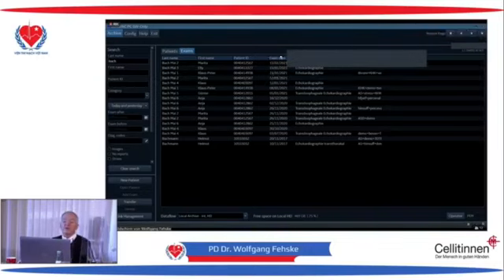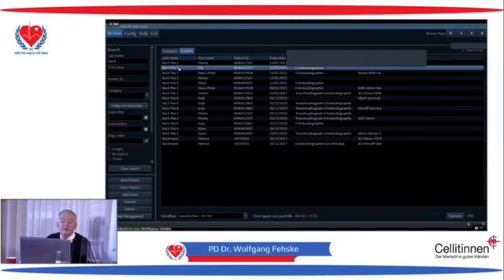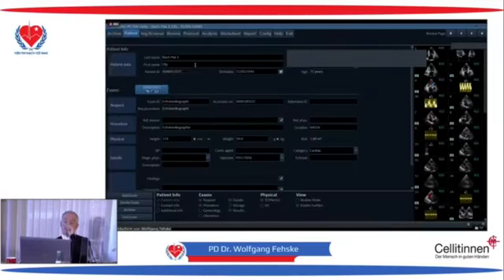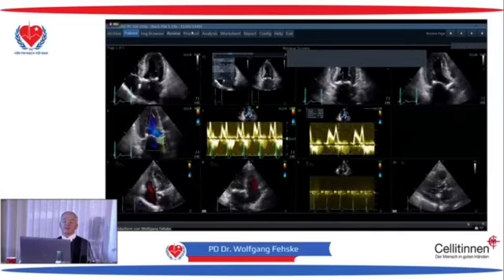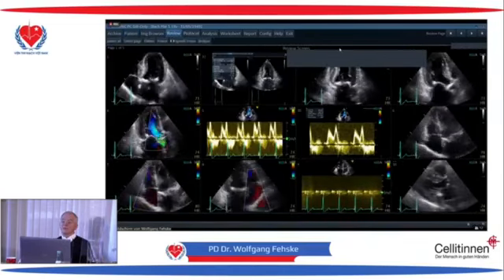So you see, these are all patients that I investigated yesterday. I will show you the next one, which is number 3. This is like in Bach Mai. You always presented me very interesting cases, and now I have another case. What is your idea what the patient has?